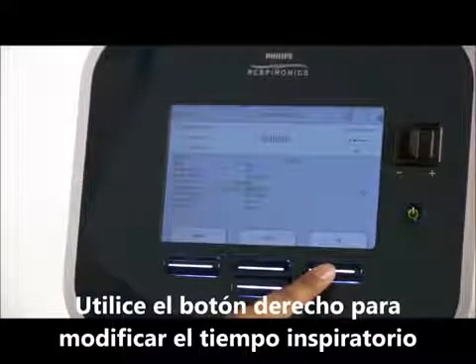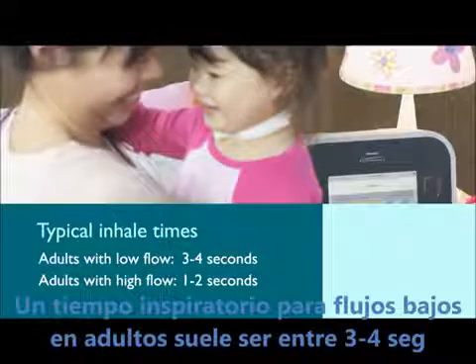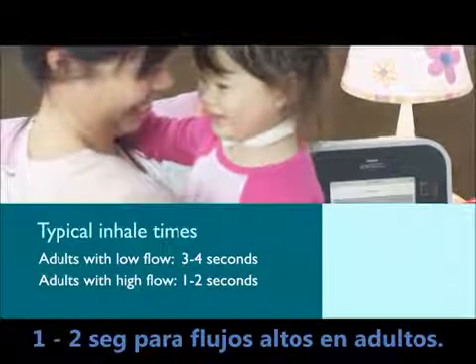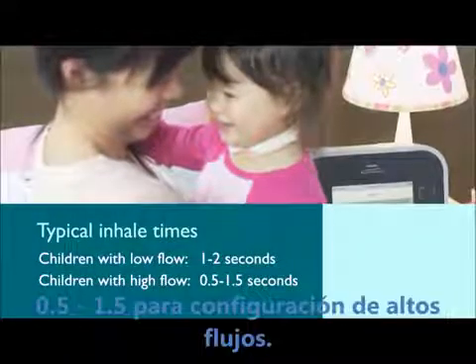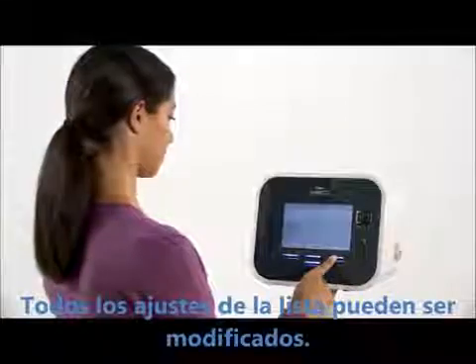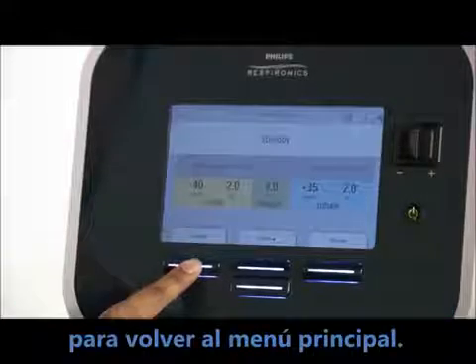Use the right button under modify to highlight inhale time. A typical inhale time for adults with a low flow setting is 3 to 4 seconds, and 1 to 2 seconds in adults with higher settings. For small children with low flow, 1 to 2 seconds is typical; 0.5 to 1.5 seconds for high flow. Press OK to accept the new inhale time. All the settings listed can be adjusted in this manner. When you have made all of your modifications, press the left button under finish to return to standby.